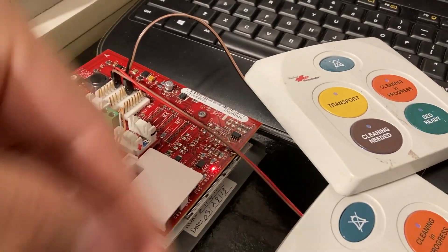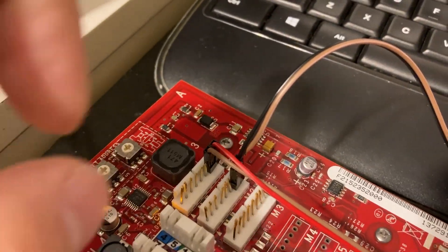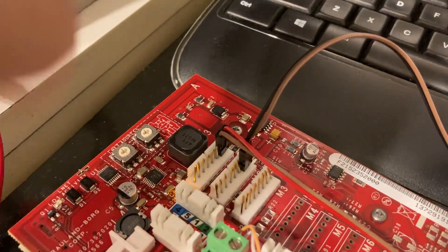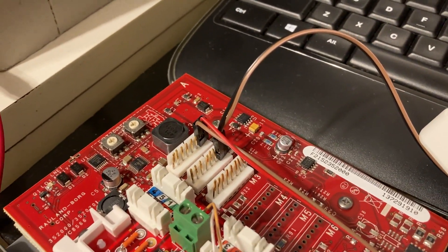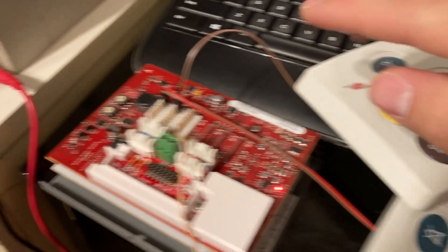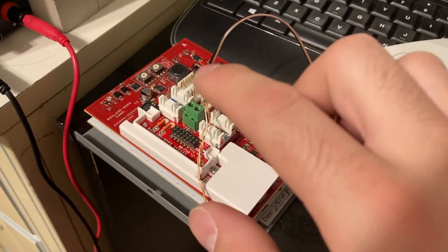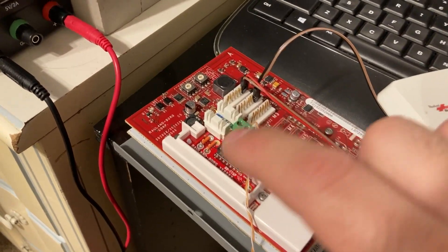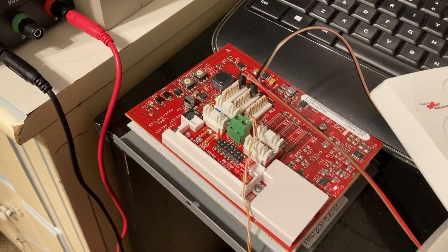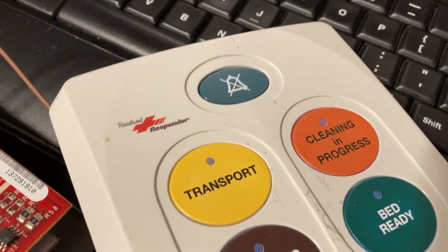The power comes in and there are all these Molex connector headers in the back. Typically you would crimp on an 8-pin connector that Rowland provides onto a Cat5 cable going from here to the device. Right now I just have power coming off this going to this, because this board has its own built-in DC-to-DC converter that steps down from 35.6 volts all the way down to 18 volts DC to operate.